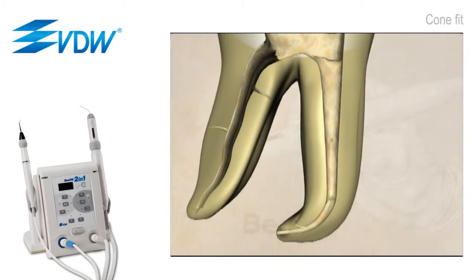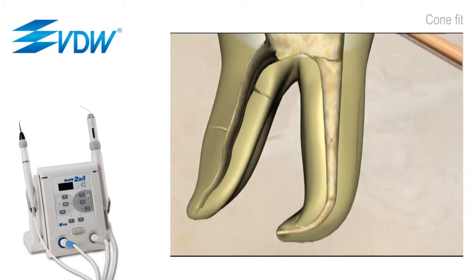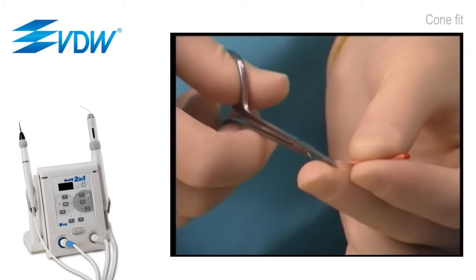A gutta-percha cone is selected to closely match the canal space. The cone is inserted to length. The appropriate cone should bind slightly at the apex and exhibit a slight tugback when removed. Here, about a millimeter is clipped off of the apical end of the cone.